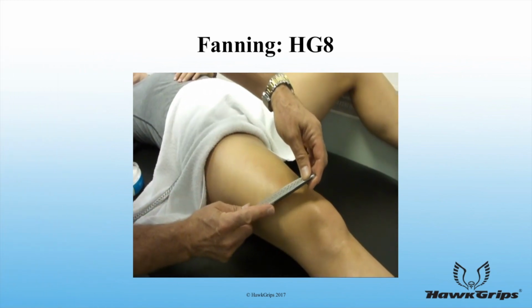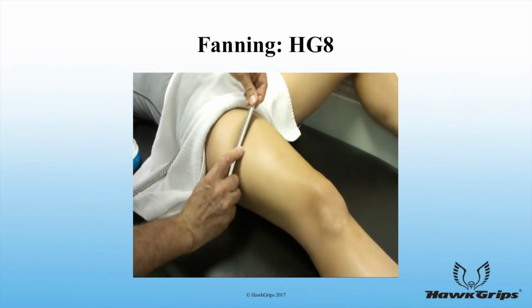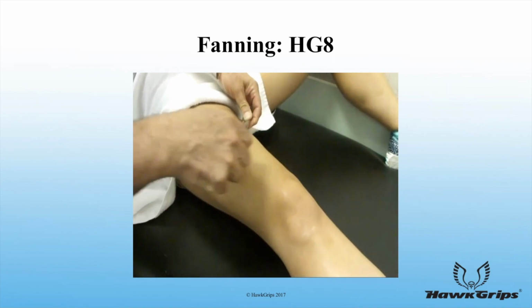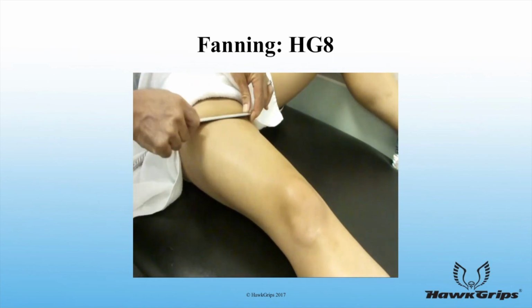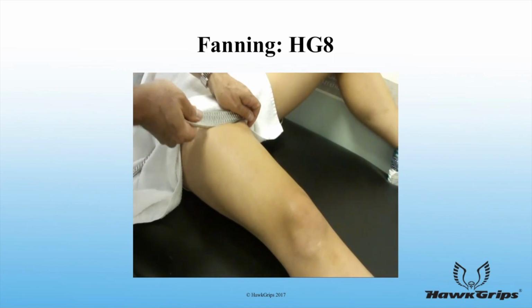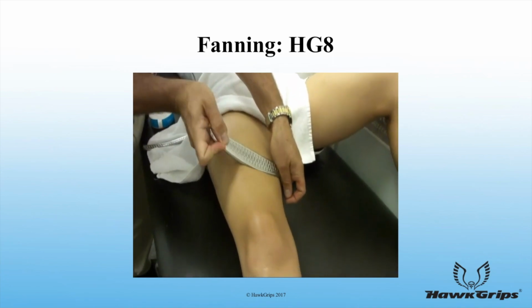Fanning strokes are ideal for crossing over muscle fibers. One end of the instrument should remain fixed and the other end of the instrument passes in a larger arc. The clinician, again, should only treat one direction at a time and consider the angle and slope of the bevel to specifically target tissue restrictions.